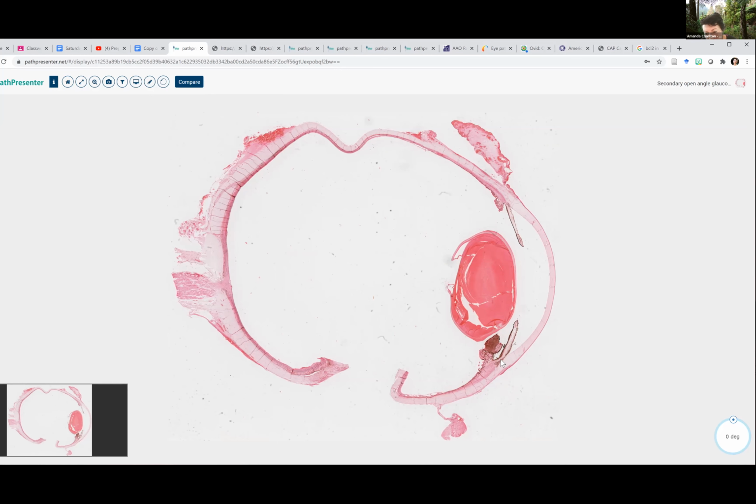And the angle, this one looks rather closed or squashed together, and there's a strange brown pigment in the angle. And if I look at the opposite end, there's also brown pigment up there. And this iris looks particularly brown on the anterior surface. So first I want to look at the tumor, and then I want to look at what may be associated with it.